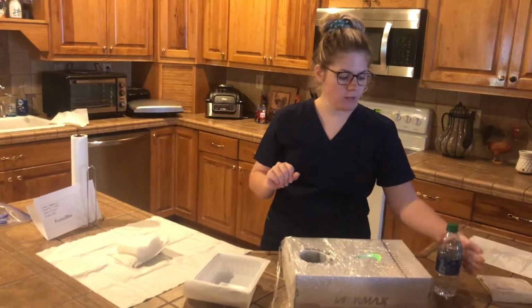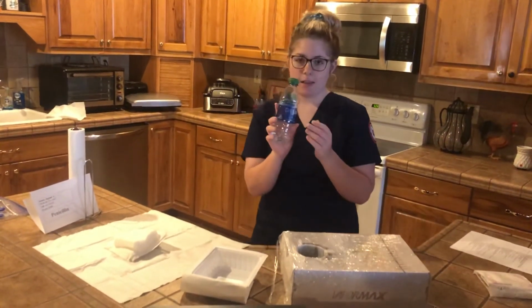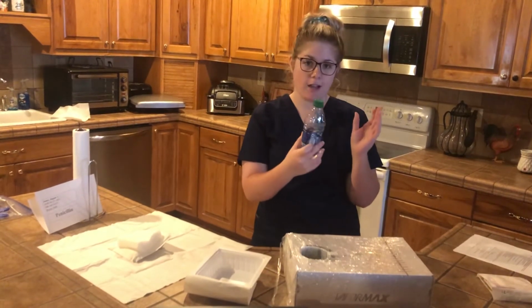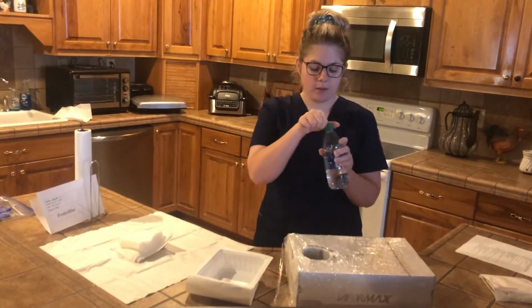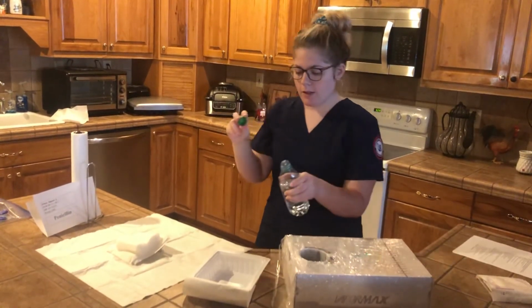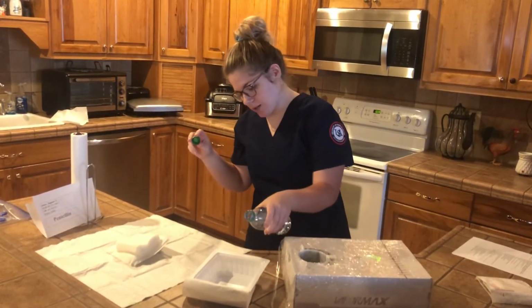I will get my normal saline label facing my palm, making sure that it is not expired and it is the correct saline. Open it and pour it gently without splashing.